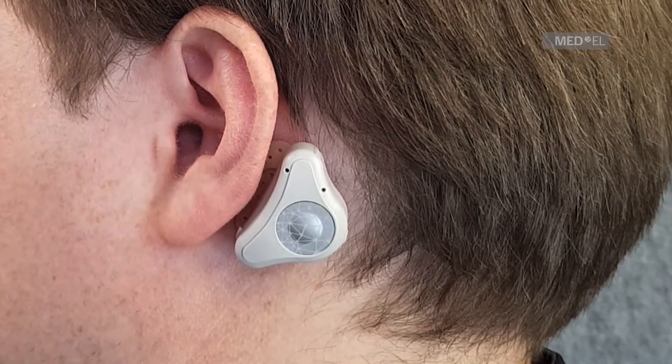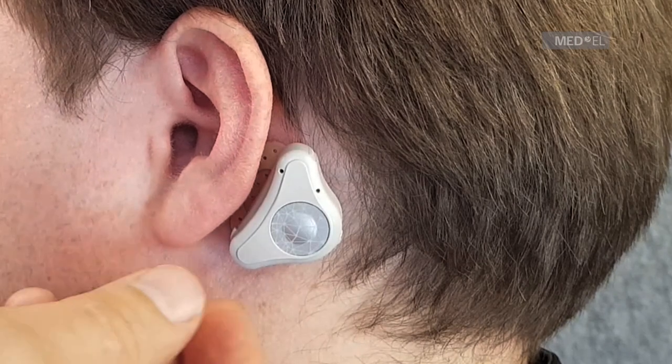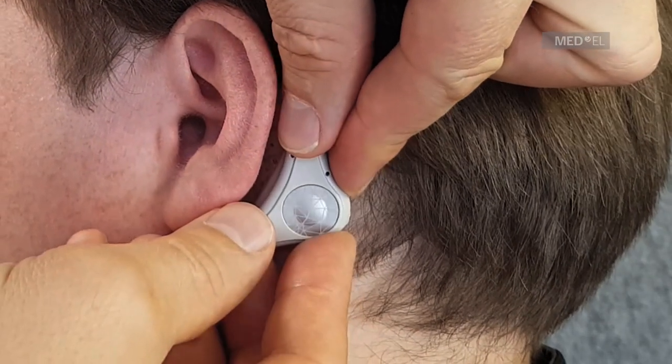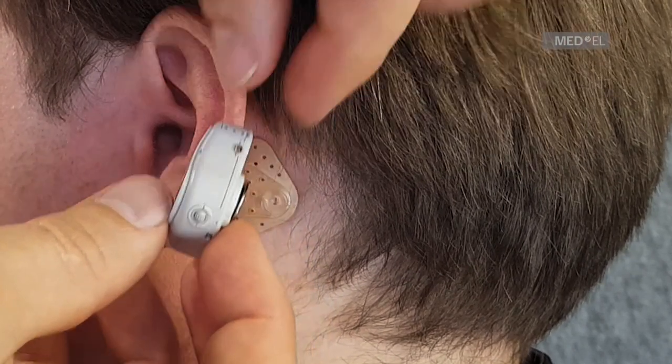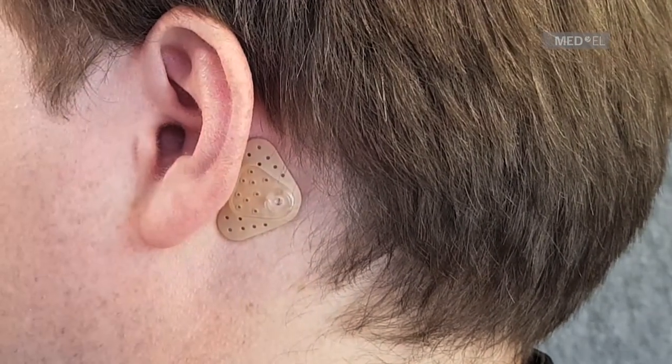To disconnect the audio processor, press down on the side closest to the ear. Tilt the audio processor off the adhesive adapter. Do not pull on the audio processor, as this may dislodge the adhesive adapter from the skin.